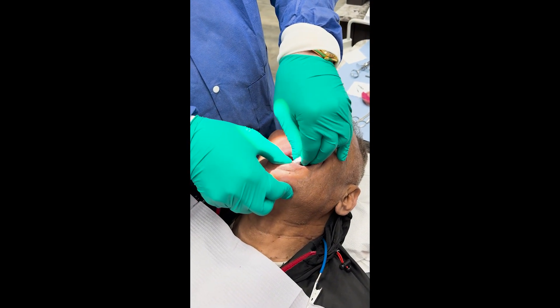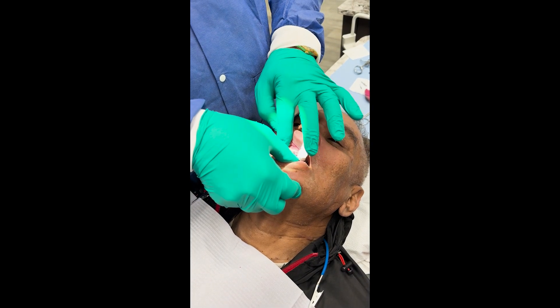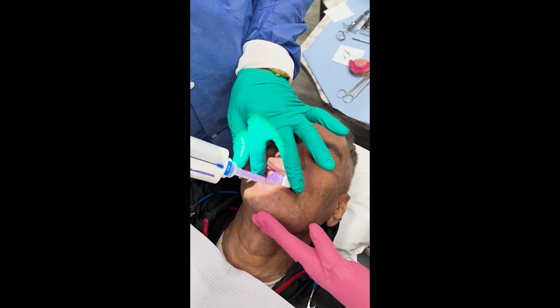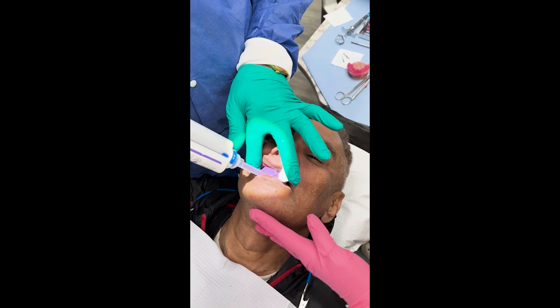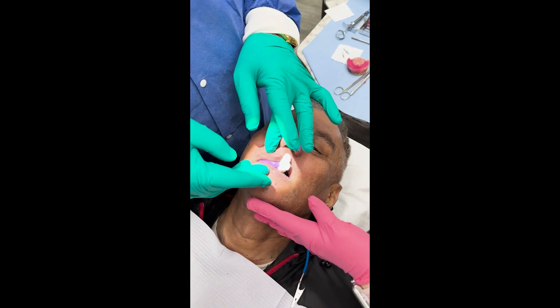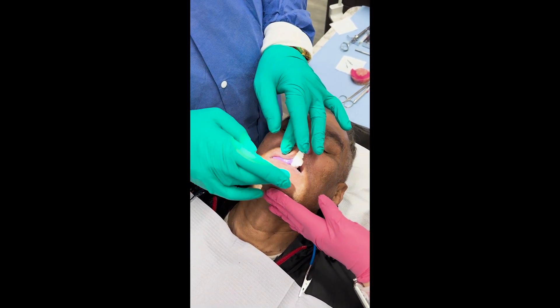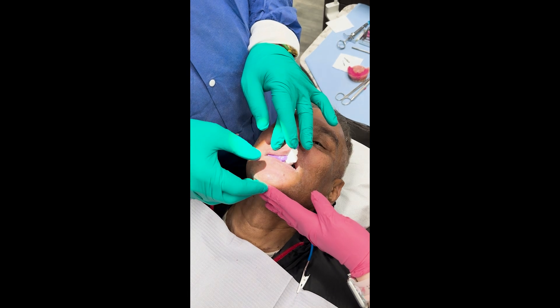Gently bite together. I'm using Regisil, but you can use whatever bite registration material you like. Just get the vertical pretty close — we can always open the vertical a little bit if we need to with the lab. You just want to get an approximate bite, and the lab will get a pretty good idea. They will know approximately how much to set the pin once they mount the case.